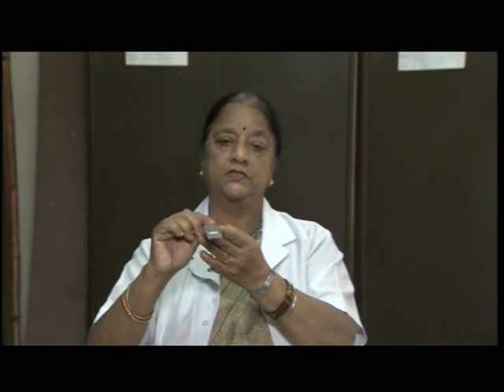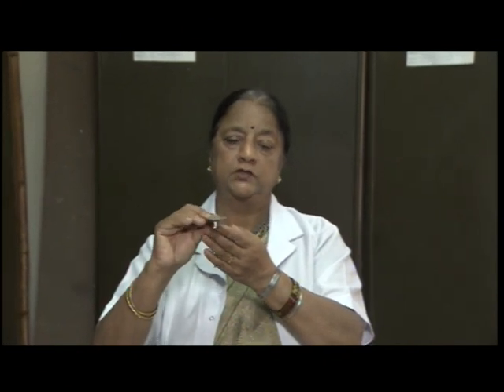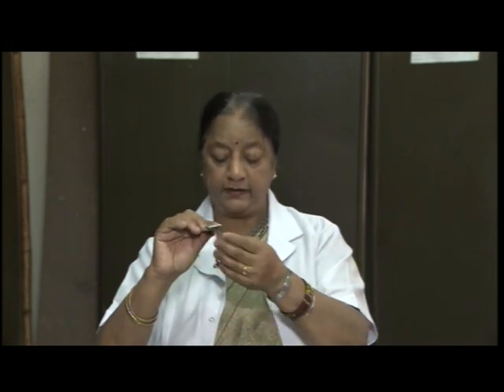Sometimes the patient cannot open the mouth, so we make use of this device, which is called tongue spatula. So, we can use this to depress the tongue and view the interior of the mouth. And if this metal one is not available, you can make use of ordinary this kind of spatula.